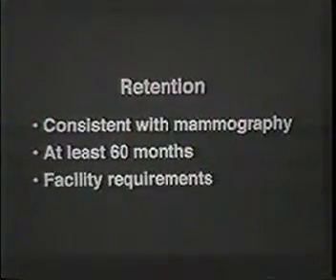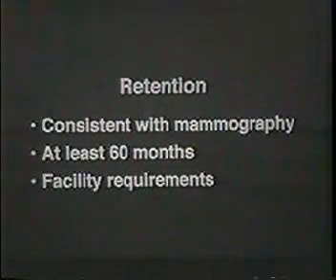In terms of retention of the ultrasound examination, the same guidelines hold that are for mammography. It should be consistent with mammography guidelines. We wouldn't want to discard the ultrasound any sooner than the mammogram. And it should never be less than 60 months or 5 years. So all mammograms should be kept at least 5 years, and that's the minimum, and the sonograms should be kept at least as long as the mammograms.